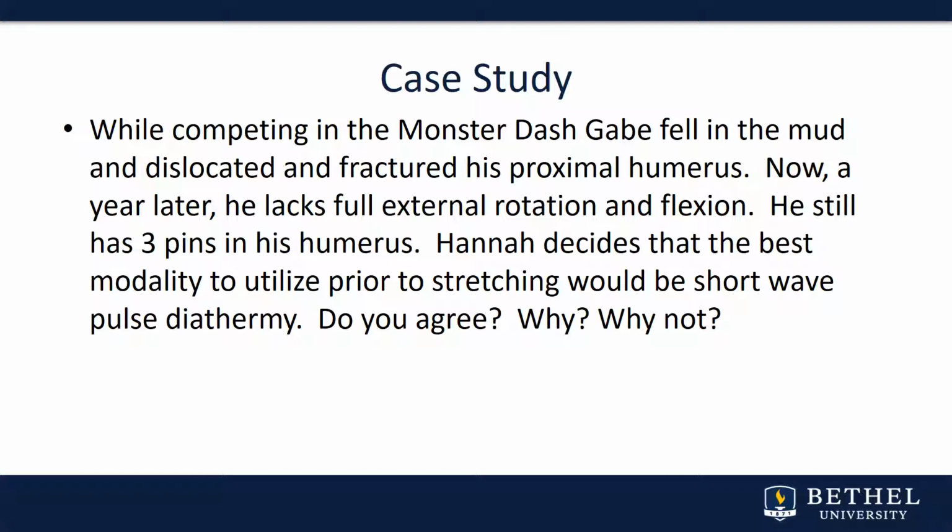However, the issue is the pins. So if you still have pins in there, metals in general are contraindicated. However, if we're using a pulsed shortwave diathermy and we're not letting it go above 48 watts for some mild to moderate heating, then he should be fine. So I would go ahead and use diathermy, just cautiously watching in case he says that it gets painful, and that would probably be because the pins were getting too warm. But in this case, it'd be a good thing to perhaps try.